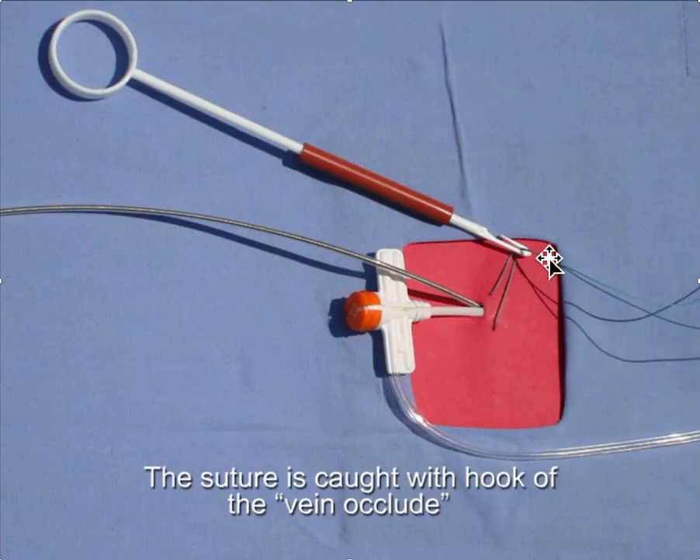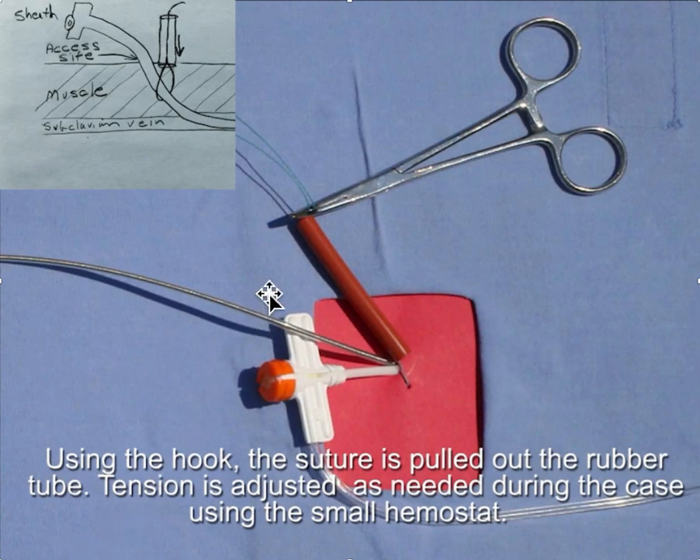We use this fish hook to grab the suture and then pull the suture up and out of the tubing. When you put tension on it, push the soft rubber tubing down with the hemostat and clamp it in place.